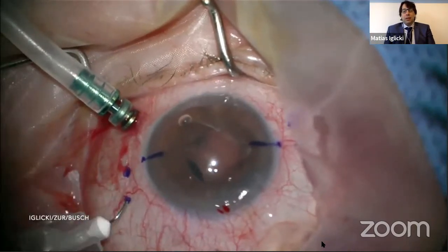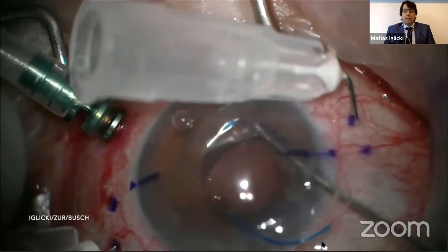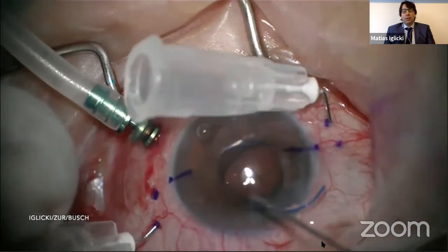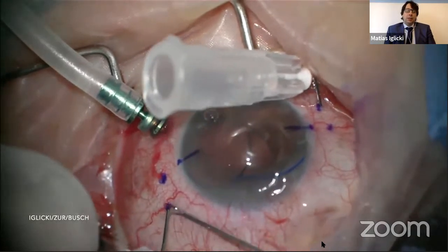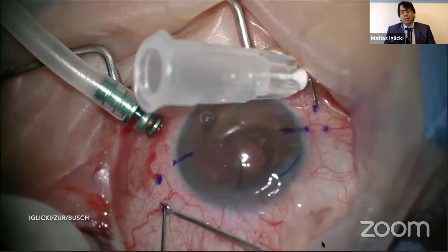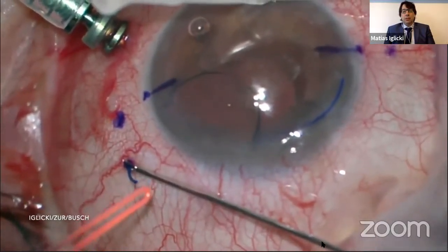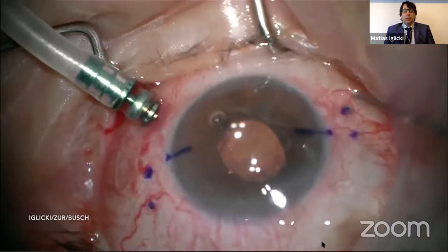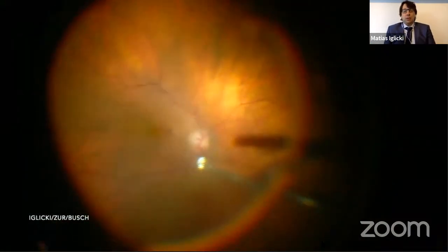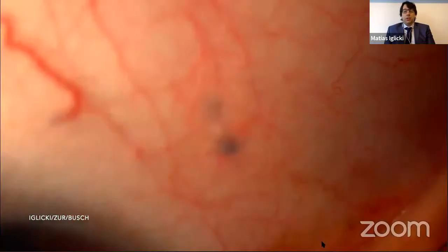And then we insert the intraocular lens, and you can see at the first attempt how easily the haptic is inserted inside the lumen of the needle. Then we go below the iris, and then we pull carefully but firmly, and you might see that there is no chance to retake and to do anything there. It's amazing how stable it is when the haptic is inside the lumen, and you take it out, you flange it with high temperature cautery, and then you create a small button, and you can see at the end how easily and how well centered. If you look closely, you might see that was a phaco without complications. So of course we finish with a vitrectomy and vitreous fluid exchange, because it was a traction and complicated diabetic patient. So as you might see here, this is how it ended up.